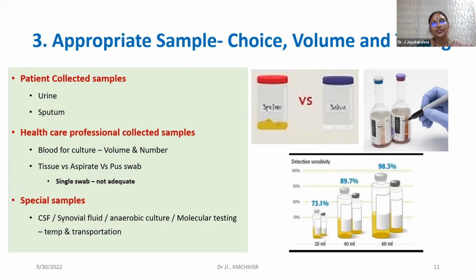So it is not just the lab that's a difference, it's also the material used for swabbing. Okay, now everybody uses the appropriate swabs for nasopharyngeal and oropharyngeal collection because it comes as a set. But the way they collect the sample is the problem. The technique in which they collect the sample, that's a problem. So your sampling is not collecting the right sample. Therefore, the organism is not getting amplified in your specimen, and that's giving a negative.